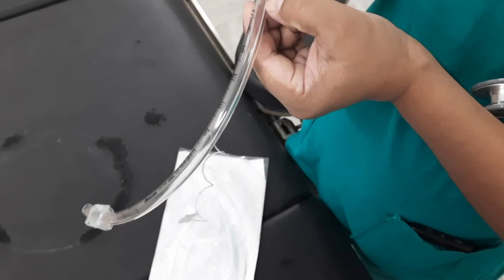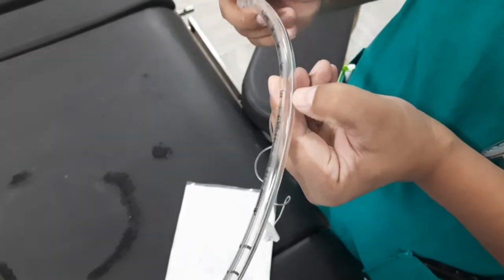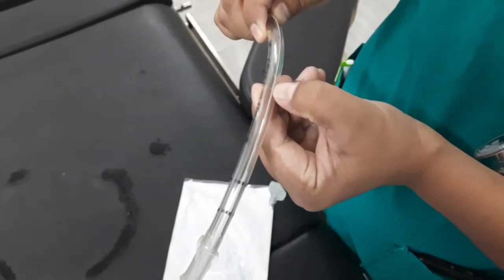Since most endotracheal tubes are made of polyvinyl chloride (PVC), they may be visually clear or opaque. Plastic is not radio-opaque, and therefore plastic tubes have a line of radio-opaque material that makes them more visible on a chest X-ray.